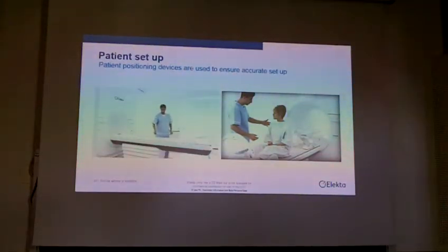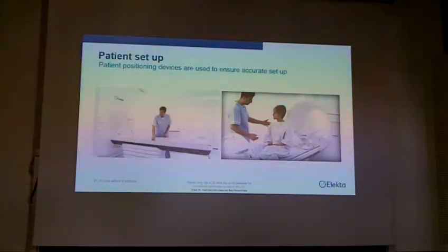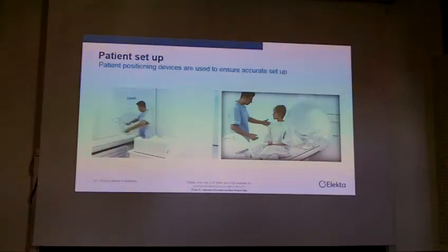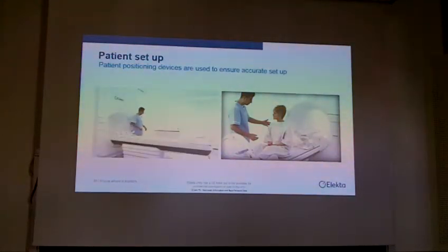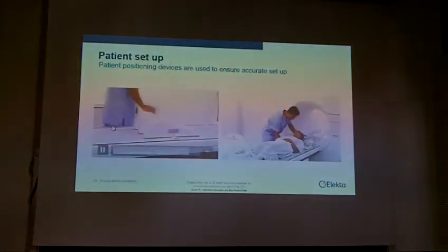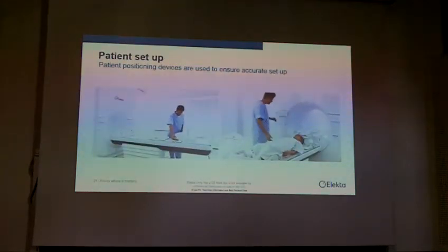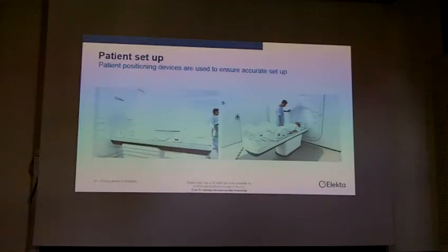We have an indexing patient positioning device on the table, which you see on the left side, and this ensures a very accurate setup of the patient. I will switch here to the next. So as soon as the patient is lying on the couch, the coil has been placed.